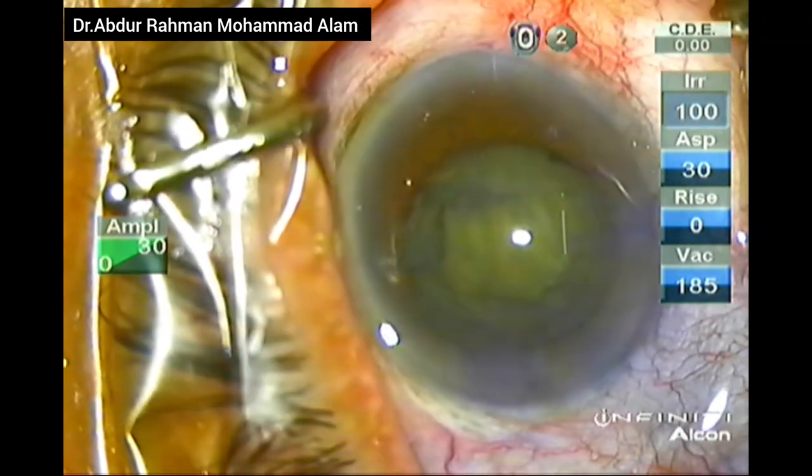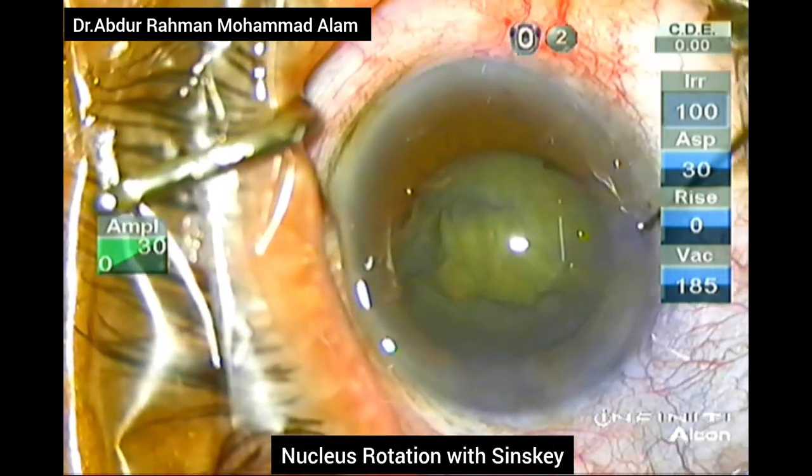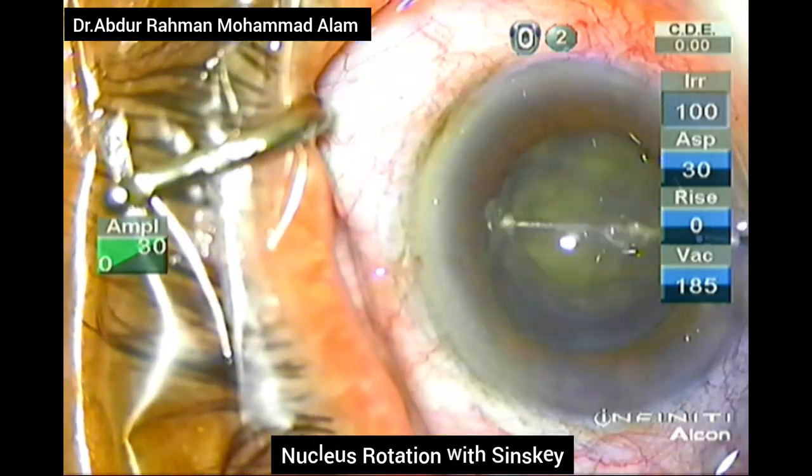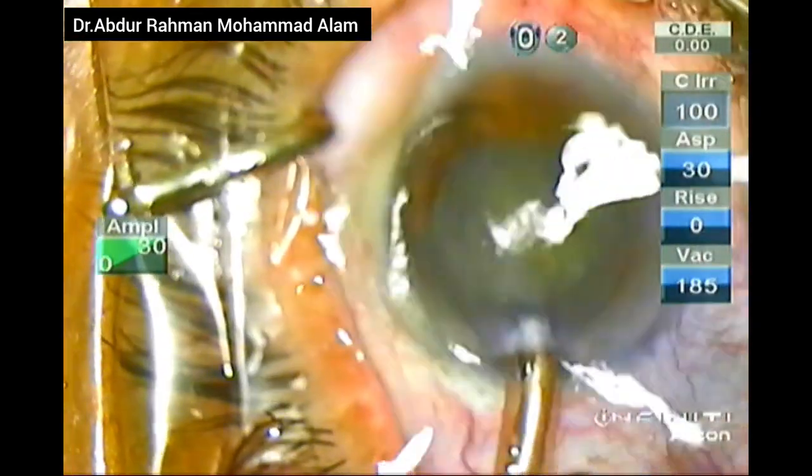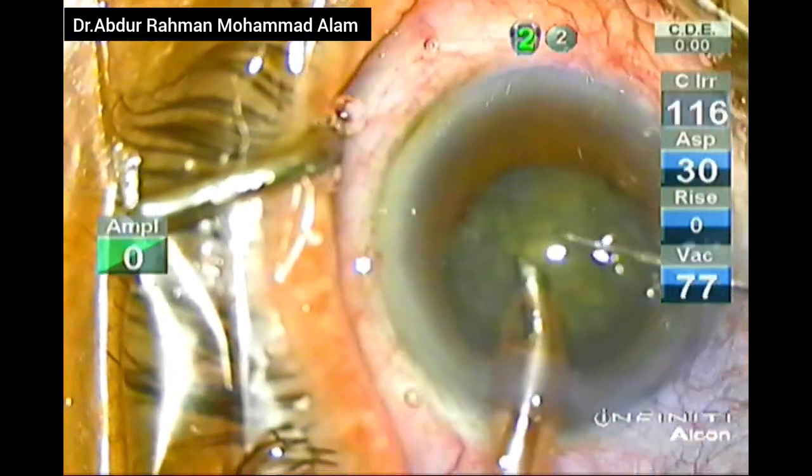The OVD is again filled into the anterior chamber. The nucleus is rotated with the Sinskey hook — it rotates beautifully. Now I will commence with phacoemulsification. Before that, I am fixing the sleeve position and exposing the phaco tip adequately for direct chop.